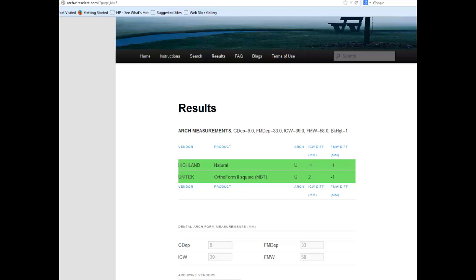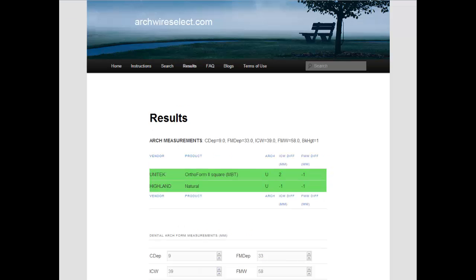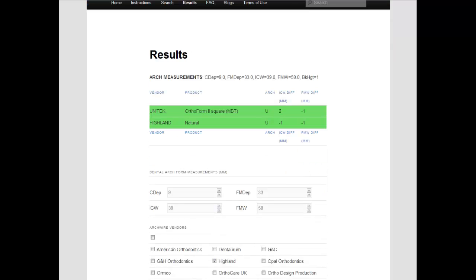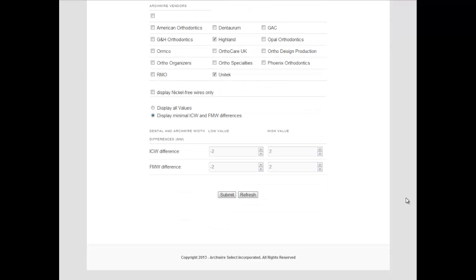Let us try a second case. Before ordering either of these arch wires, we fit a rubber facial mask over our typodont patient. We notice an aesthetically wide buccal corridor and decide to change the treatment plan. In the new treatment plan, we keep the canines in place but expand the posterior segment by at least 2 millimeters and at most 5 millimeters per side. The canine width differences remain the same, but to expand the first molars, we increase the arch wire width by 4 to 10 millimeters.